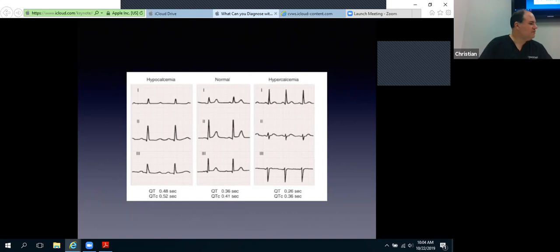The antipsychotics and stuff. Right. Then with the antipsychotics, QT interval gets prolonged as well, right. And so this is what we're following. So you're going to start off with sub-normal, and then you're looking to see, do they become this with administration of antipsychotics, or if they already have this, you don't give them an antipsychotic because it'll further delay the QT interval. And if you do that, you're more likely to send the patient into VFib. But is it also a calcium component, or is that just because of?